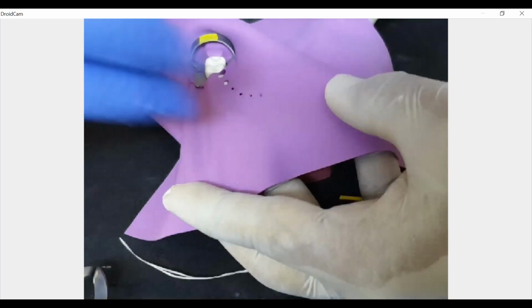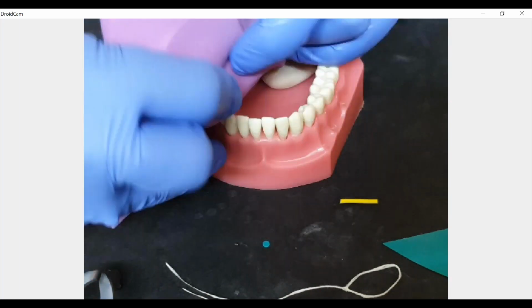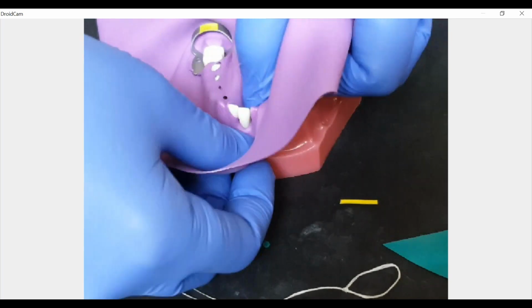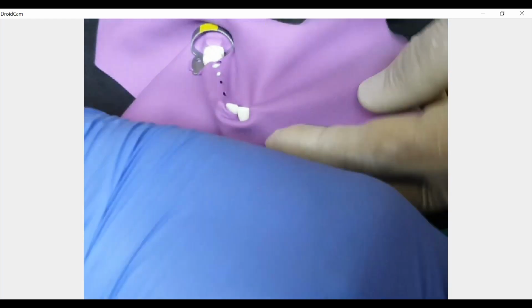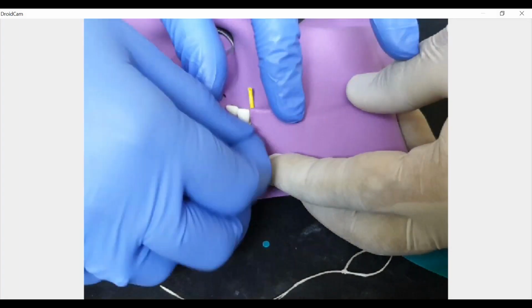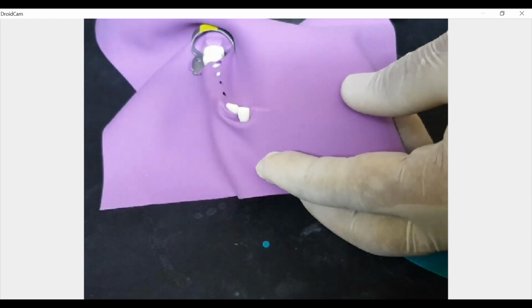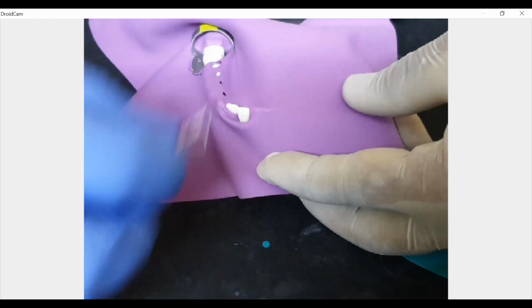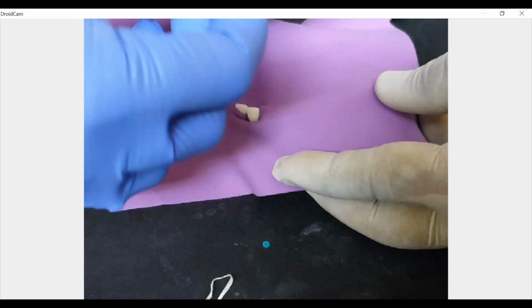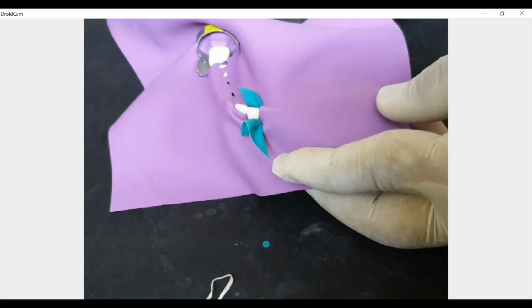Before I do anything else, I will go to my central here. Use the knife-edged technique to engage it and place my sheet. Suppose I don't want to place this, remember how to remove the wedge without causing any trauma to the gingiva underneath. I can use a floss tie, or I can use that rubber dam piece which I have, the triangular piece. So I can use this also, stretch it a lot and just use knife edge technique and it is engaged. So let us keep that.